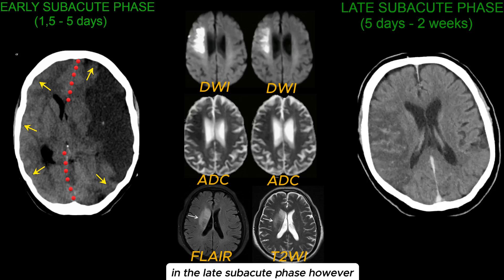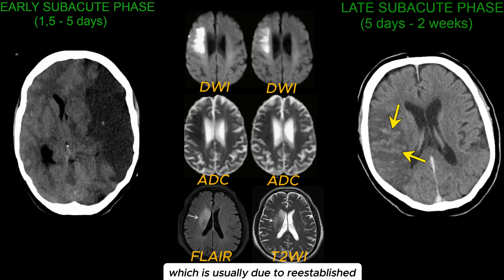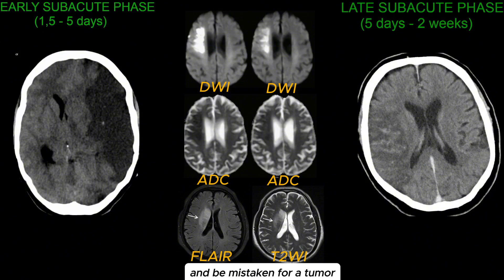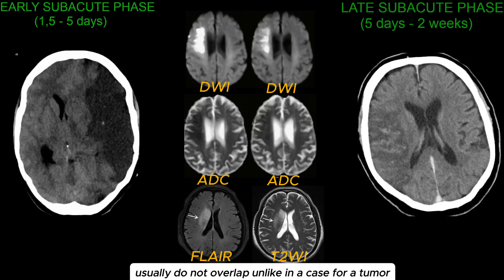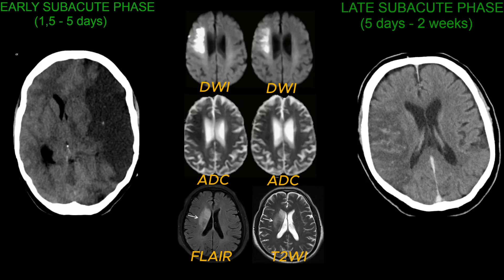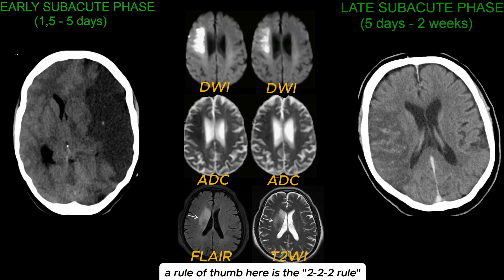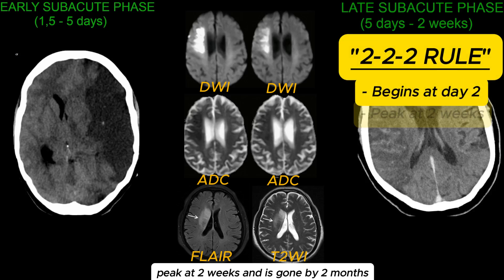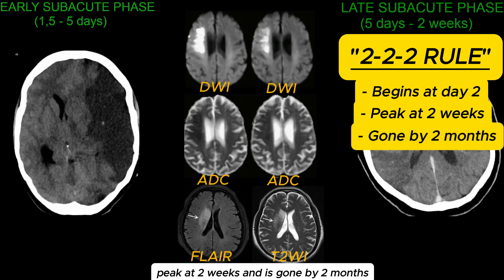In the late subacute phase, we start seeing gyral enhancement, which is usually due to re-established flow into the affected area with leptomeningeal collaterals and other new vessels. This enhancement may cause confusion and be mistaken for a tumor. Note however that the mass effect and enhancement usually do not overlap, unlike in the case of a tumor. A rule of thumb here is the 2-2-2 rule: enhancement may begin at day 2, peak at 2 weeks, and is gone by 2 months.